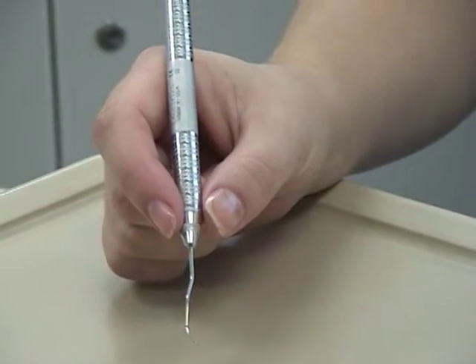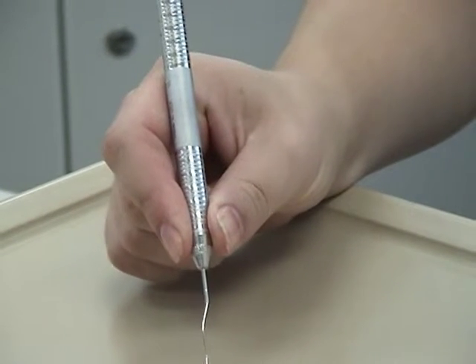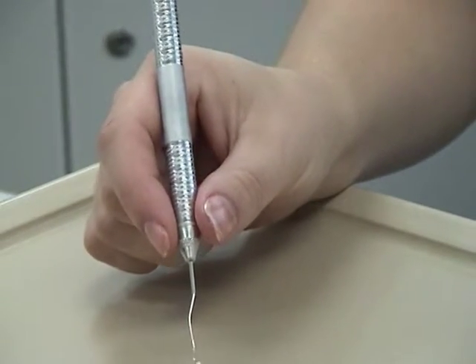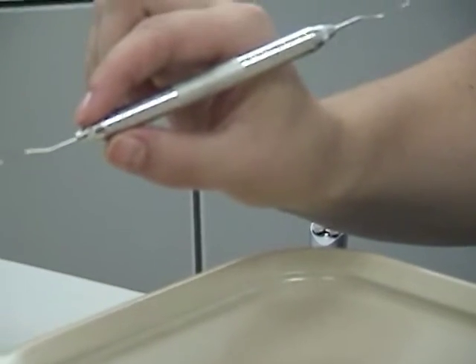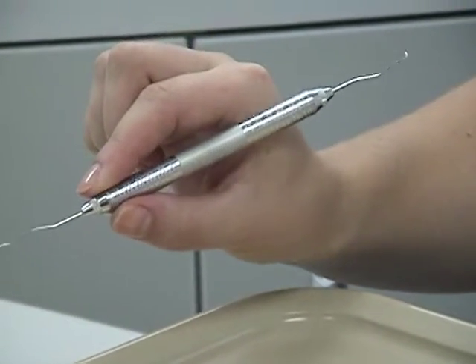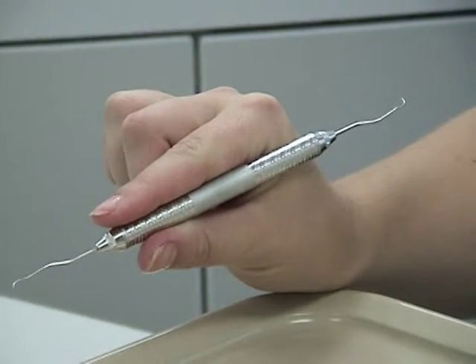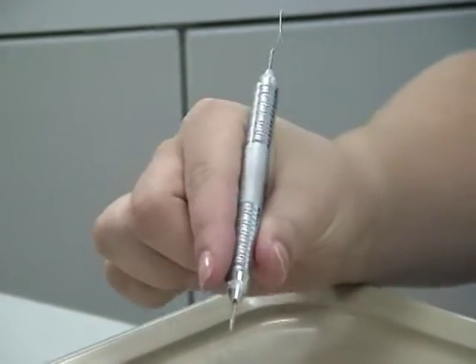The fingers hold the instrument in a relaxed manner. If they are blanched, you are holding the instrument too tightly. The index finger and thumb curve outward from the handle in a C shape, making it easy to roll the instrument during instrumentation. If the fingers become flattened or go into a U shape, you are holding the instrument at the incorrect area of the finger pads.